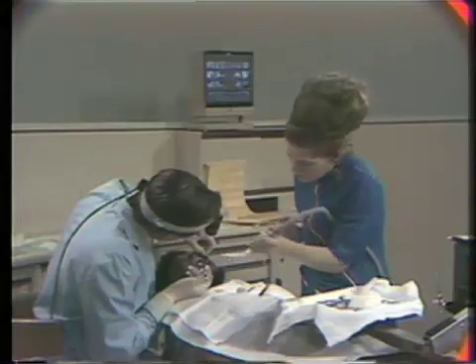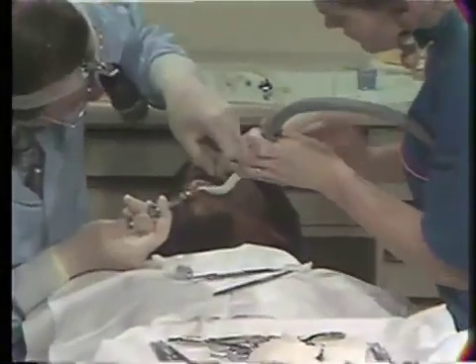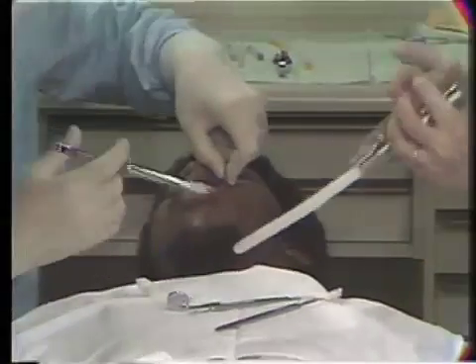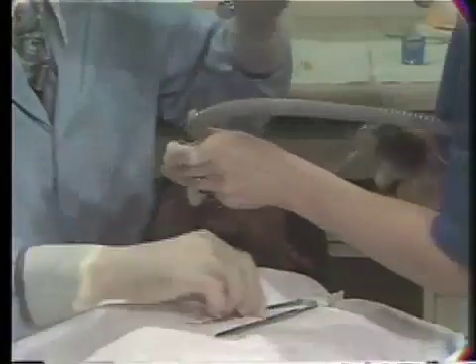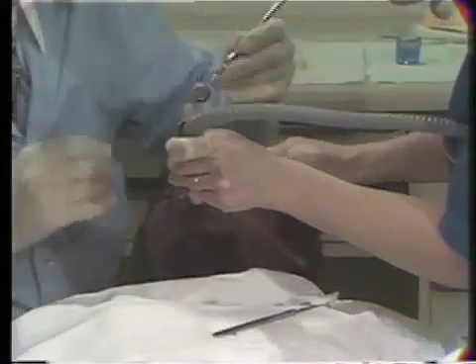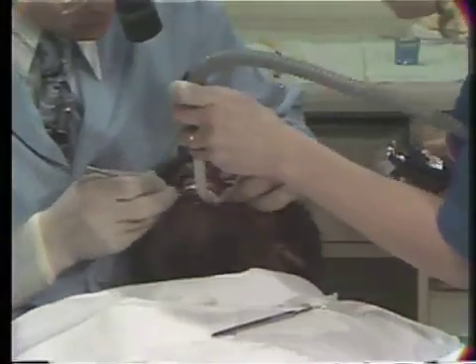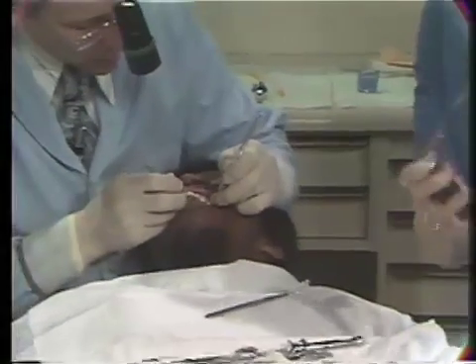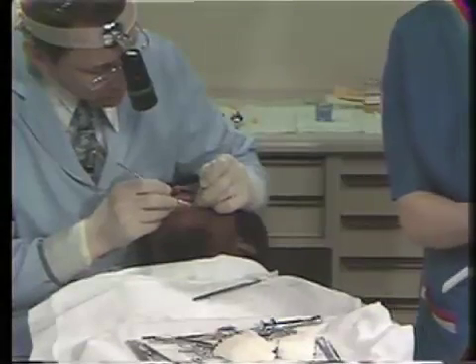Evacuate there, Betty. Use the water stream, Betty. Go ahead. She rinsed out the topical anesthetic as well as any local anesthetic spill that was in the mouth to make it a little more comfortable for the patient.